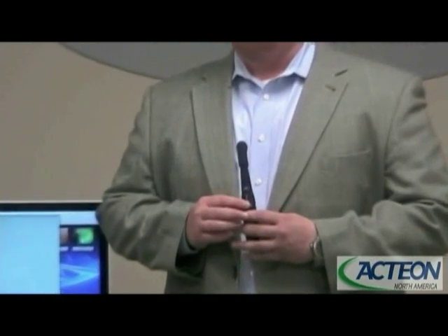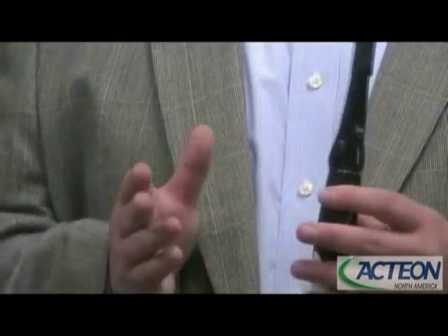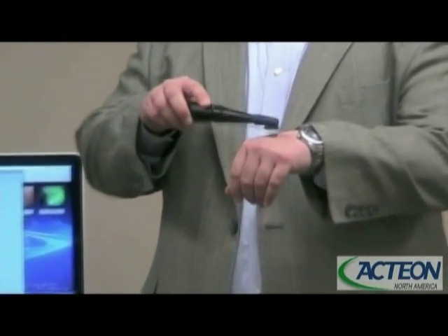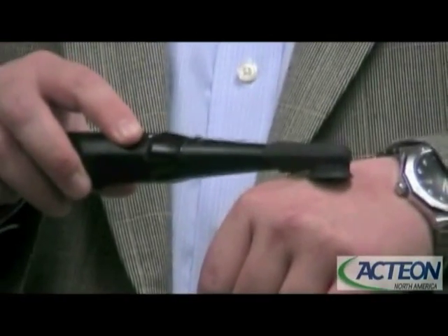What this mode and these caps are designed to do is give you a built-in fulcrum to not only help keep the shot steady, but also to help isolate that blue LED light to give the fluorescence the best environment to be successful. These caps are designed to be placed directly on top of the structure, and you're not locked into the occlusal, so feel free to roll to your buccal as well as your lingual sides.